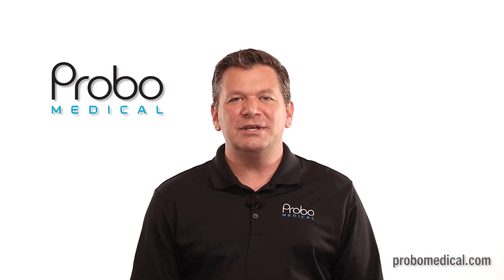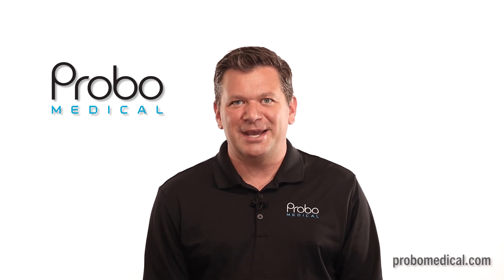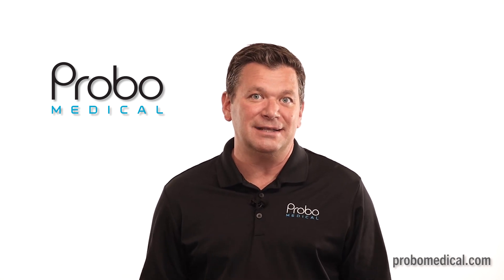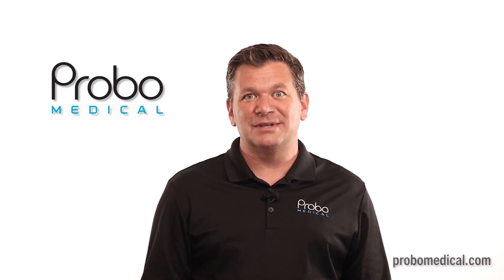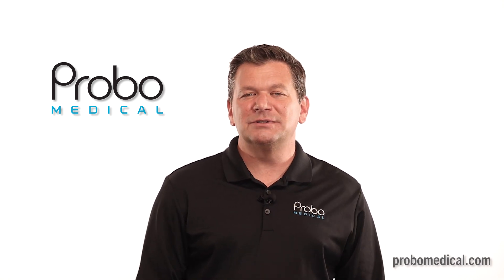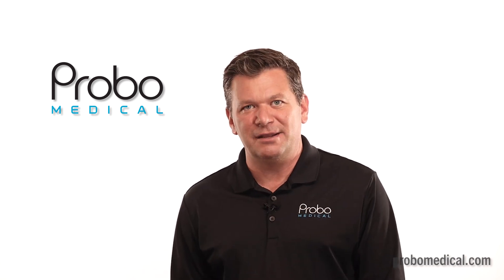For 3D/4D OBGYN, the GE Voluson has always been one of the favorites for many reasons, so when they told me that the Resona's 4D imaging was beautiful, I was a little skeptical. They told me it compares to earlier versions of the top rated GE Voluson E10, and for general purposes would be considered better than the Voluson E6 and E8. However, those needing advanced high-end features of the Voluson should look at the late models of the Voluson or the Mindray Imagine i9, which has the same 3D/4D as the Resona i9T but includes more advanced OBGYN features.